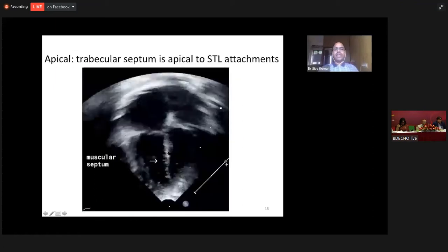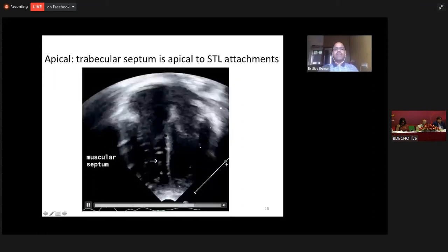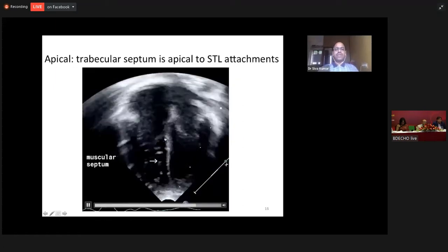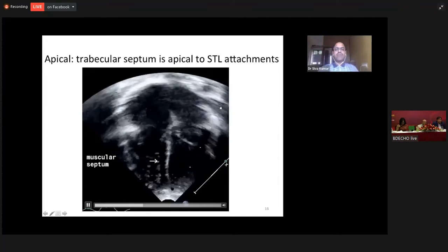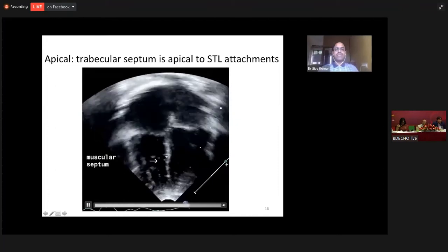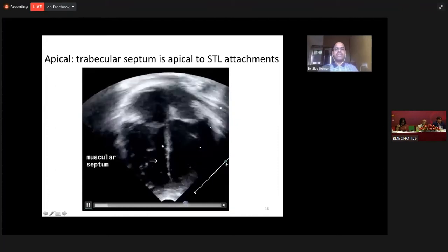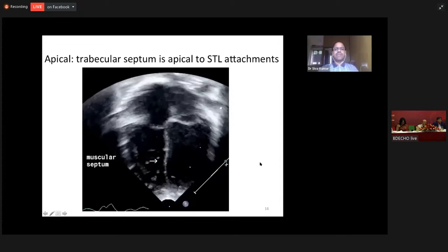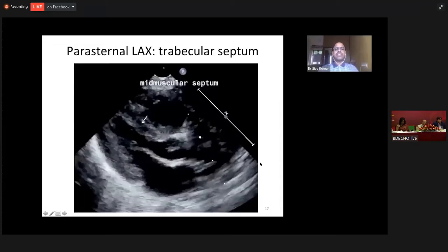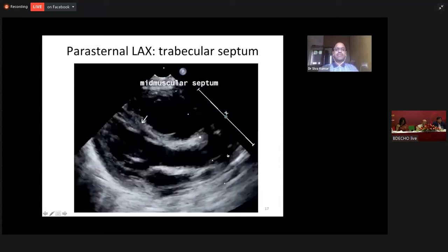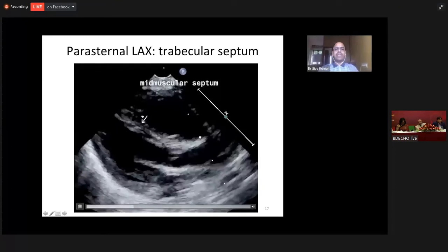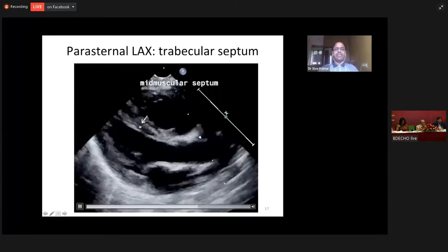In the apical four-chamber view, the portion that is below the inlet septum up to the apex — the whole area is the muscular septum. Since it is a very vast area, we can subdivide it. The portion that is occupied by the middle of the muscular septum is called the mid-muscular septum.